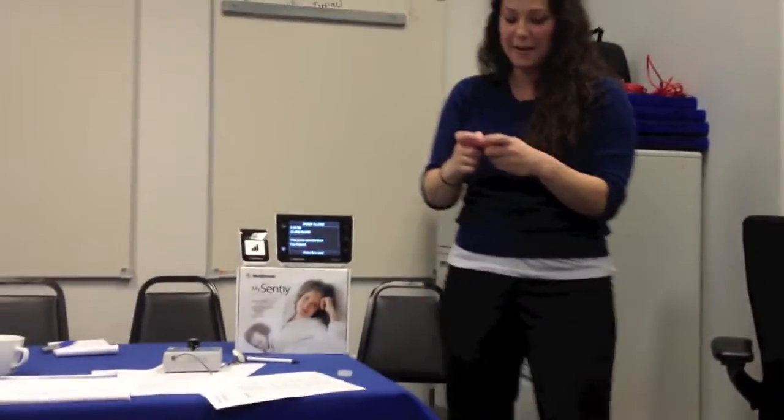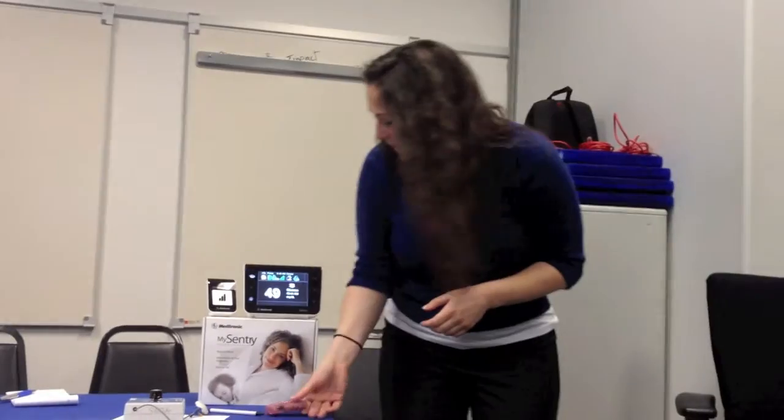There you go. So, as you can see, we've now cleared it, and you'll be able to see that it's going, and it'll show you the arrows on this screen too, so you can see at what rate you're dropping, and especially if you have a rate of change on there, you can really identify that.